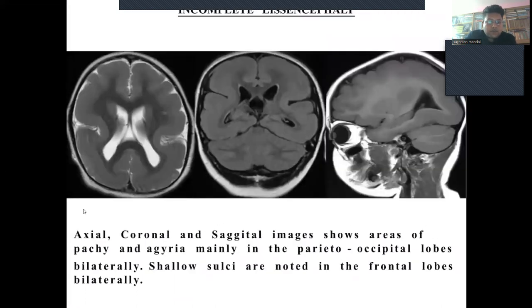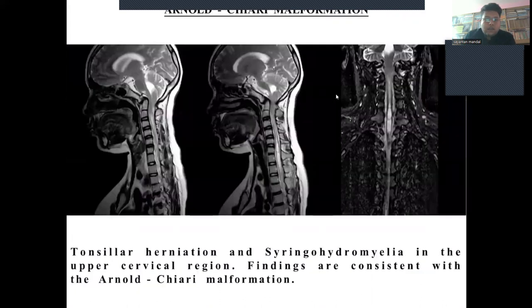In this case, axial, coronal, and sagittal images show areas of pachygyria and agyria in the frontal lobes bilaterally. This is a case of incomplete lissencephaly. In this next case, we can see tonsillar herniation with syringohydromyelia in the upper cervical region, findings consistent with Arnold-Chiari malformation.